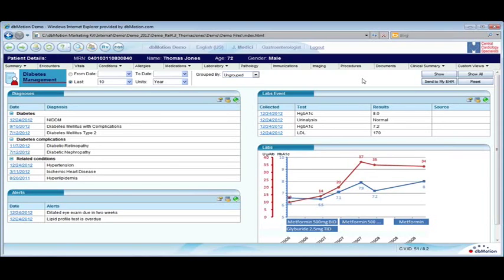So whatever PACS capabilities that you have, the answer is yes, but please take that with a grain of salt. We don't have a lot of clients doing that right now. Most people are just content with reports within the DB Motion view. So there's probably a lot of nuances in the ability to manipulate those images within this view, and I'd just be careful answering that question from a technical standpoint.